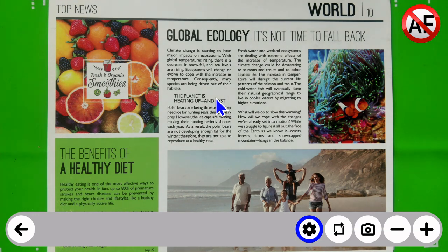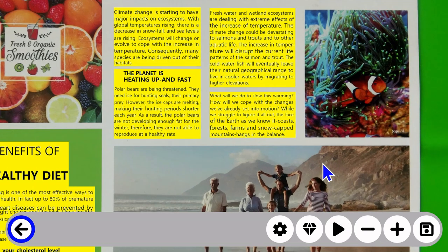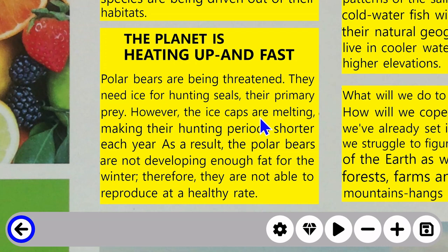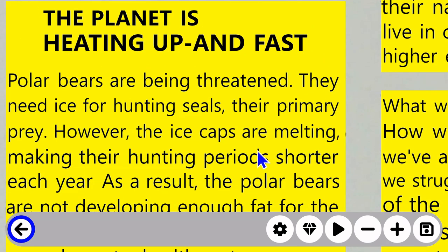We are going to perform a capture now using the camera, center right icon in the lower right of the screen, to capture the page that we're looking at. So you'll notice that it immediately applied my contrast settings that I have set up for myself when I perform a capture. I have black on yellow as my preferred contrast. And you can see that we have done that OCR in English and converted this text into our diamond edge, that lossless font. So again, we can zoom way in on this and it will maintain a really nice, clean, crisp text for us to view there.